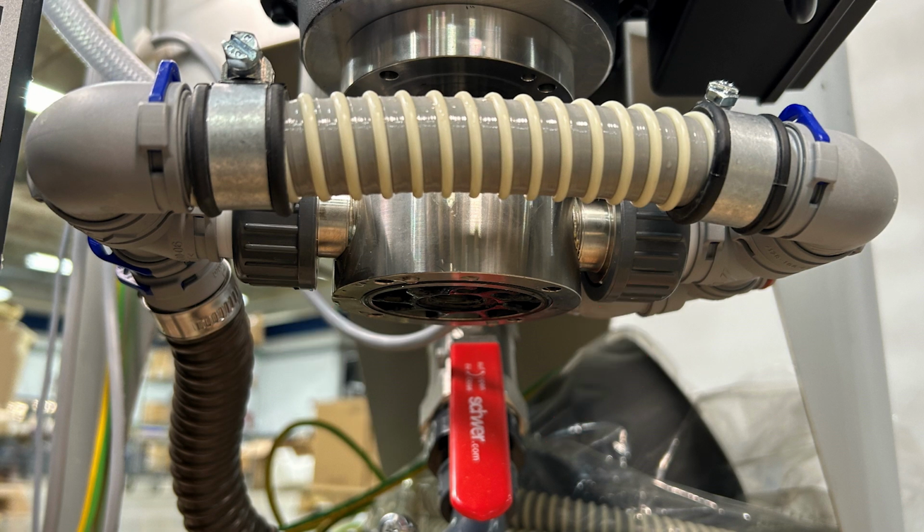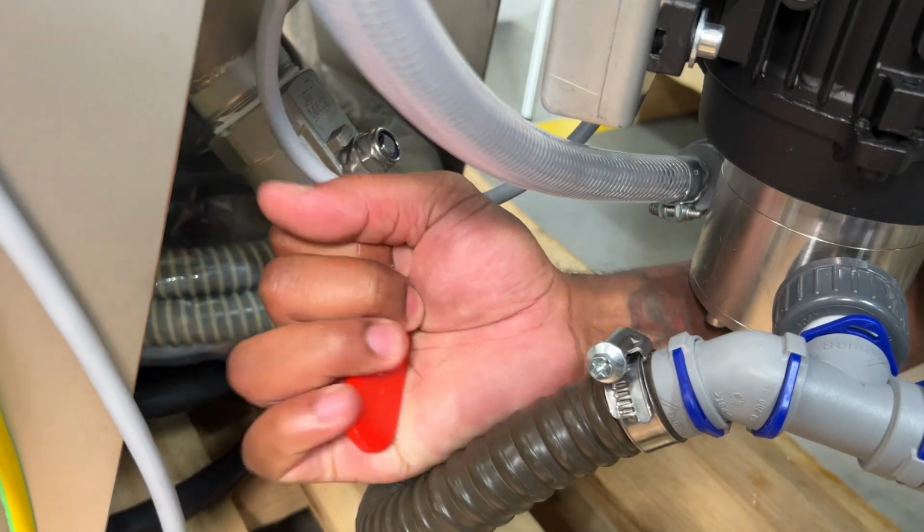Repeat the same process on the opposite side. Open the drain valve on the separation tank.